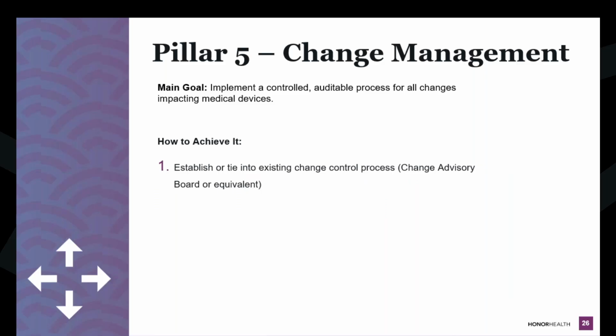They're making network changes all day long. Who does it impact? You guys, right? You have to go out and figure out why that took down your equipment, what's happening here. So tie yourself into that existing process and have a voice on it. When they say, oh, we're going to switch out this switch over here, you say, okay, what equipment does that impact? They say, oh, we're not sure, here's a list of MAC addresses. Okay, great. So before we do that, let's figure out what equipment is actually impacted before we just say yes, let's go ahead and do that, because it's never happened, right, Lynn?